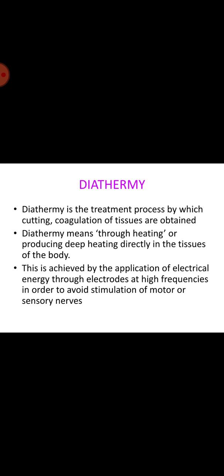employed. The power levels required for electrosurgery are below the threshold for neural stimulation, provided that the diathermy frequency is in the high frequency range and at least 300 kHz. Both the Faradic and electrolytic effects are largely eliminated during the flow of current through the human tissues. This then allows the exclusive utilization of the thermal effect in high frequency surgery, providing both applications for cutting and coagulation.